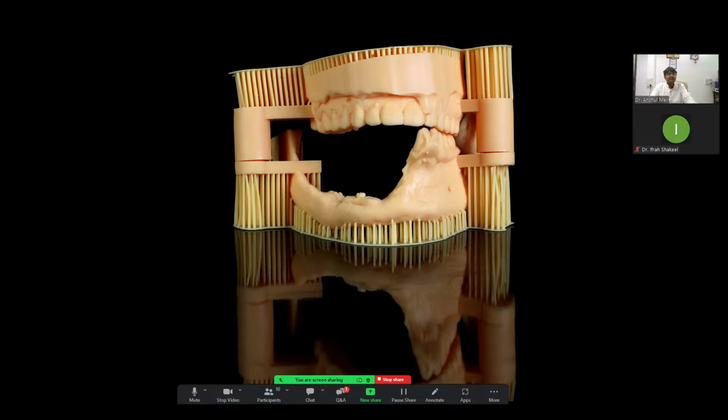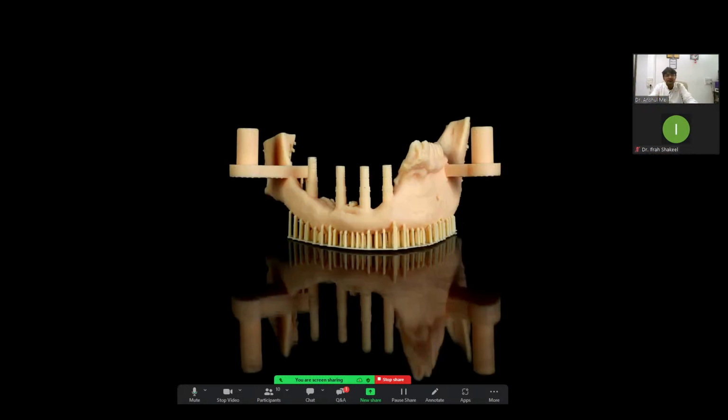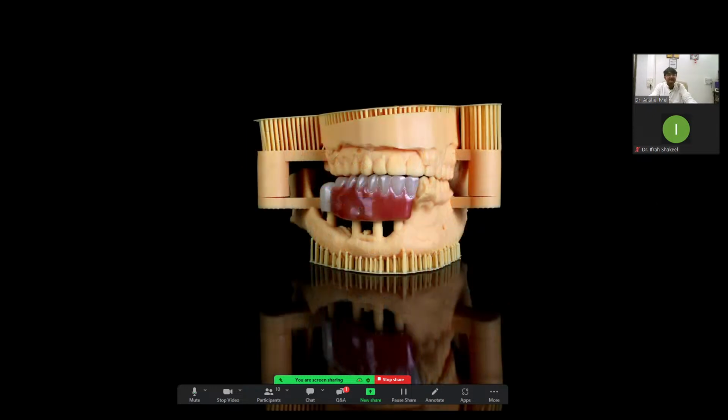In the same way, this is a partial mandibular case in which you have a lot of height from the occlusal plane to the bone, so the crown-to-implant ratio differs when you are planning the prosthetic. In this case we planned the implant with guided surgery. We use a special implant in which half of the area is covered by the implant body, and then my prosthetic part will start. This is the prosthetic we designed pre-operatively.